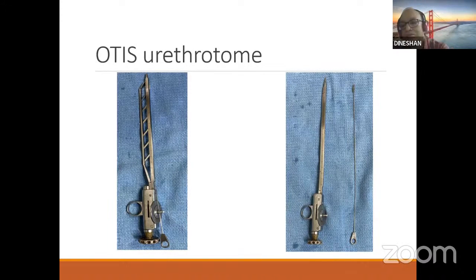Now, going to the urethrotome: what is it? This is an equipment used for doing urethrotomies. Two common situations where you use this nowadays: if you want to pass a larger instrument like a resectoscope or any other instrument in a male patient with a narrow urethra. Otherwise, if you force a larger instrument, you are sure that you may injure the urethra, and you are asking for a stricture. So this is one of the indications.